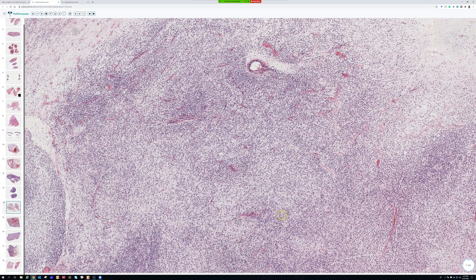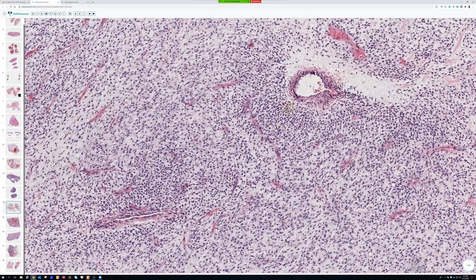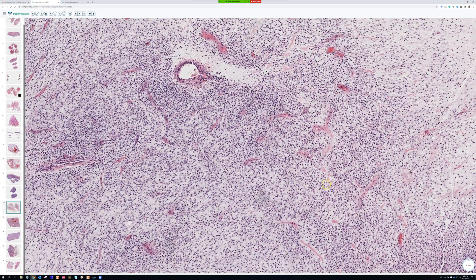This area here doesn't look like normal myxoid liposarcoma anymore. Sometimes it can be solid sheets that look almost like Ewing sarcoma or a poorly differentiated round cell synovial sarcoma. This case still has some myxoid background, but the cells are way too cellular and I think they meet criteria. I've had times on a needle where I said there's increased cellularity but I don't know if it's enough to call it round cell.